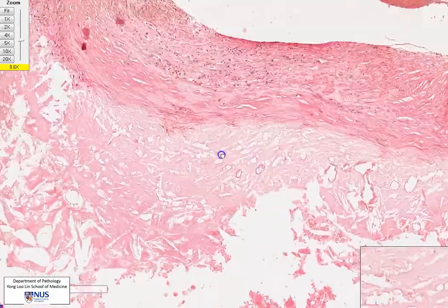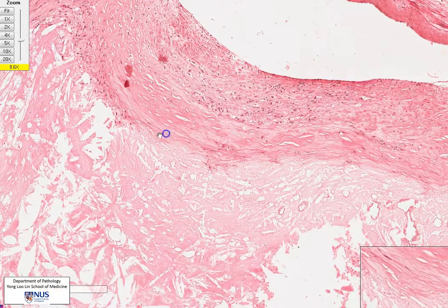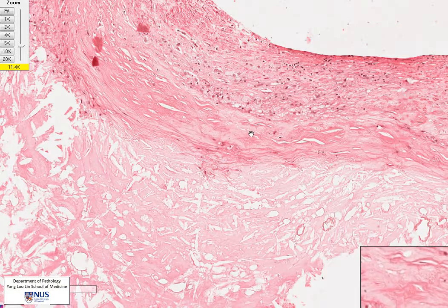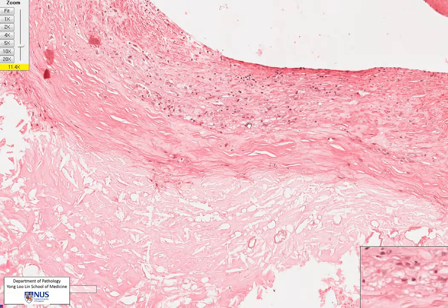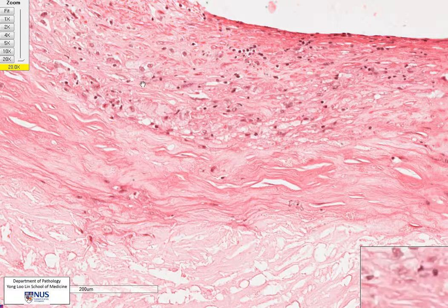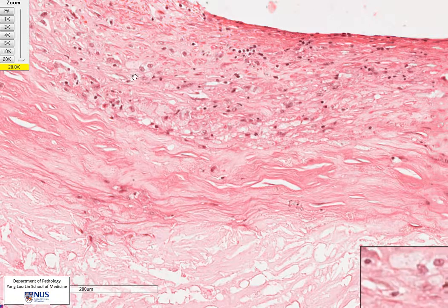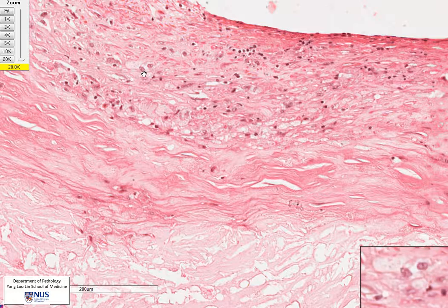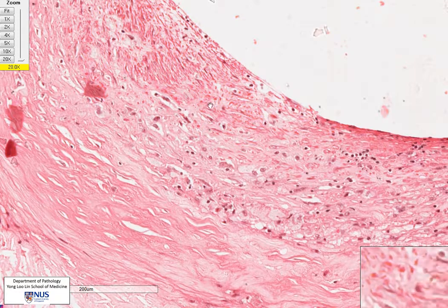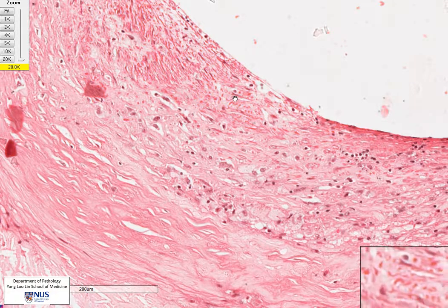Now surrounding this atheroma, there are these areas of pinkish material with very few cells. This is extracellular material, including things like proteoglycans. We also see some cellular material — inflammatory cells. Over here, we have a couple of foam cells with abundant pale foamy cytoplasm and relatively small nuclei. And we also have some proliferation of smooth muscle cells as well as fibroblasts, with these spindly looking cells with elongated nuclei.